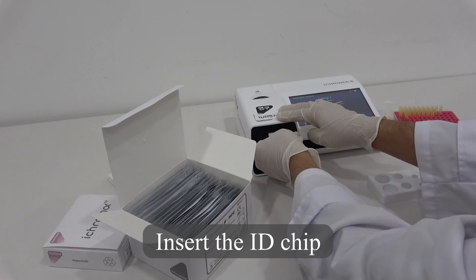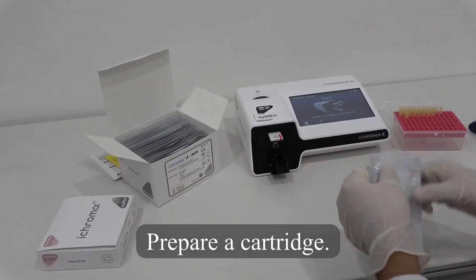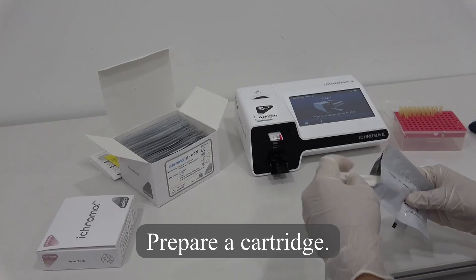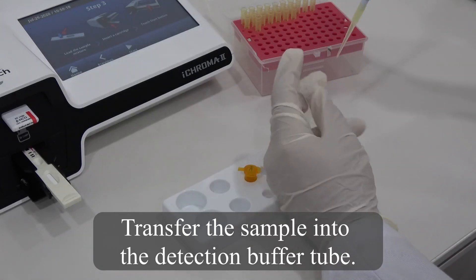Insert the ID chip. Prepare a cartridge. Transfer the sample into the detection buffer tube.